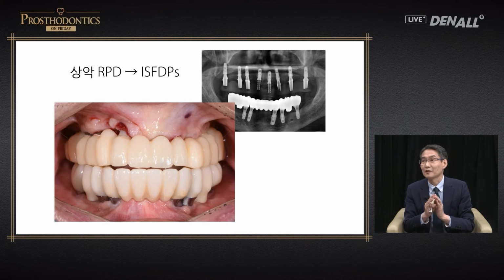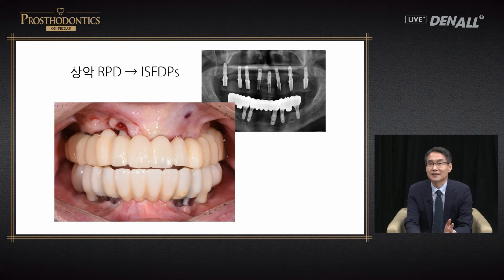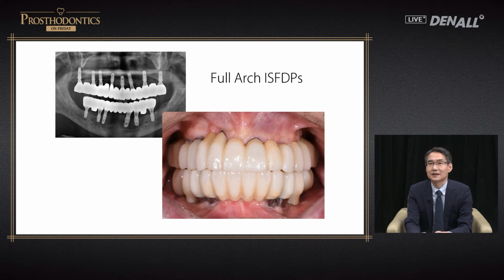I'm going to segment the final prosthesis. However, I made a provisional in the form of cross arch and did rigid splinting. The patient used a fixed prosthesis from the day of implant placement, so the patient was free from removable prosthesis. The healing period was significant, but the final prosthesis was delivered well, and I've been following up this patient for about 3 years now.